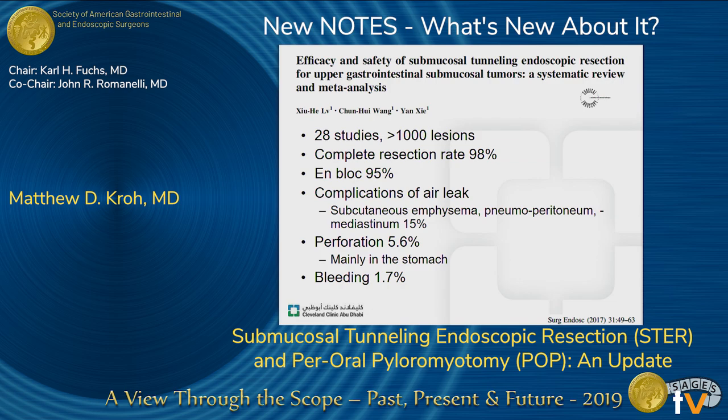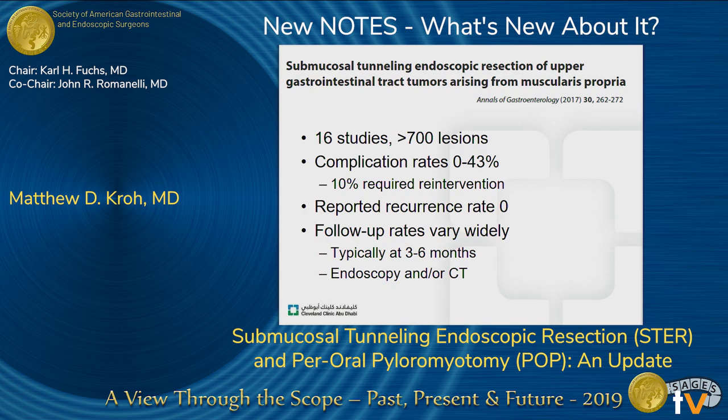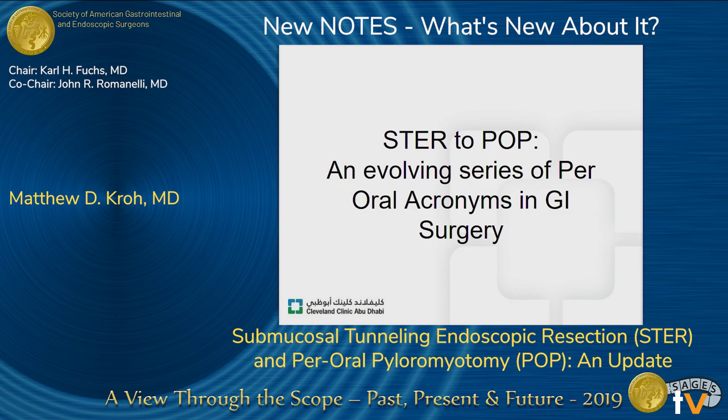How about longer-term outcomes? This is another collated study of 16 studies, 700 lesions, highly variable complication rates depending on definitions, but recurrence rate was zero in this group, and the follow-up rate obviously varied based on institution and study. Okay, so STER is a good minimally invasive mechanism to access submucosal tumors of the proximal GI tract.